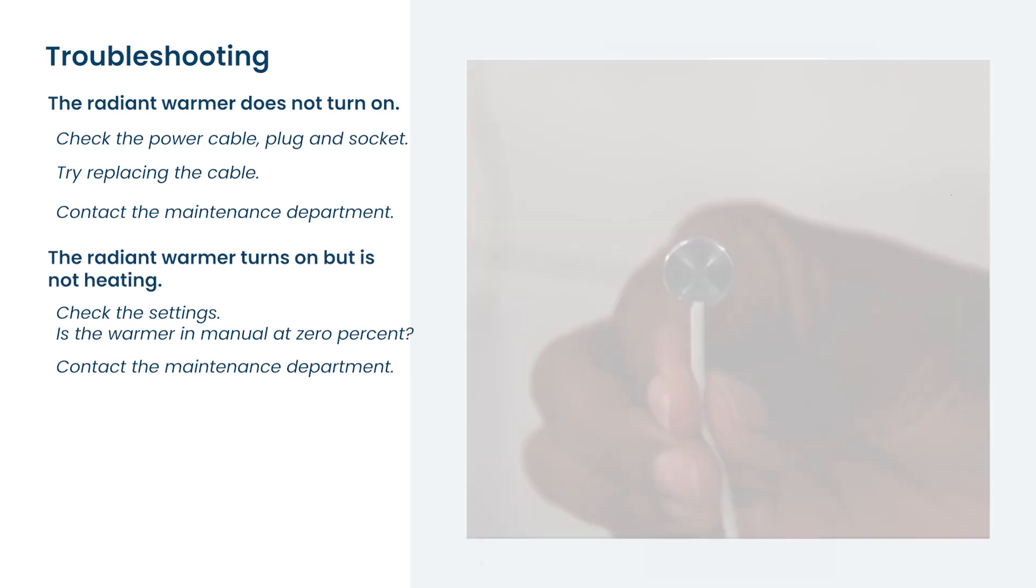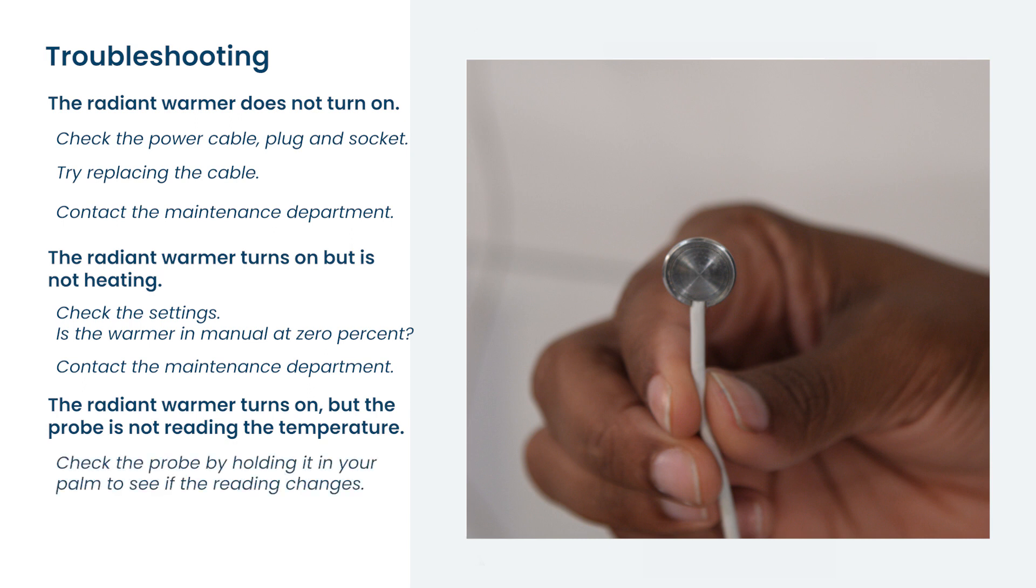The probe is the most delicate part of the machine. If it disconnects, an alarm will go off. But it may also stop working. If that happens, you can check it by holding it in the palm of your hand and seeing if the temperature reading changes. If that does not work, then try replacing the probe with a spare. If there is still no reading, then contact your maintenance department.